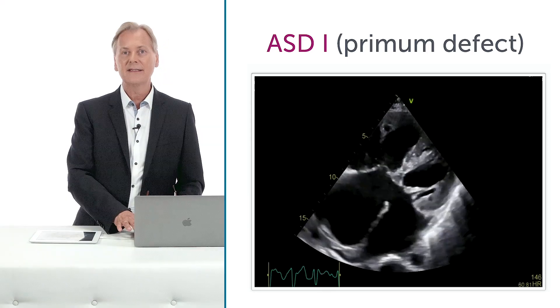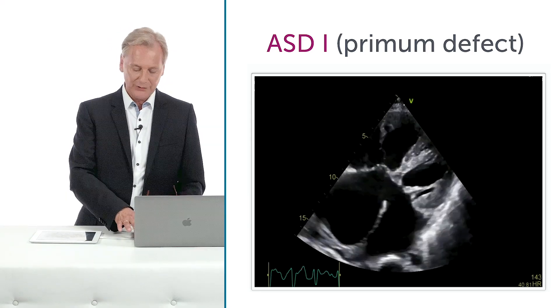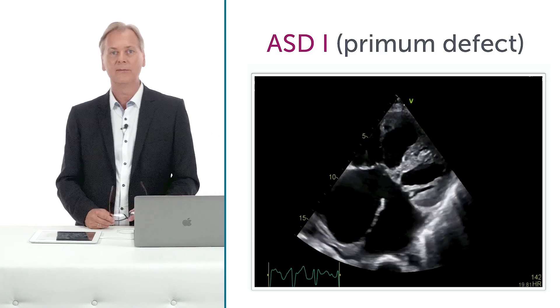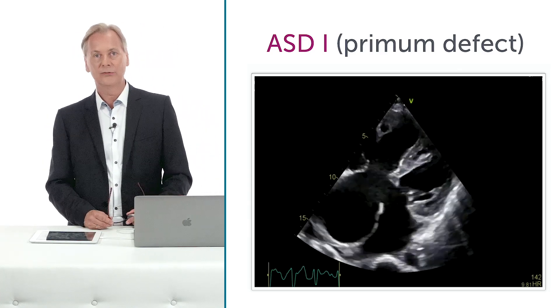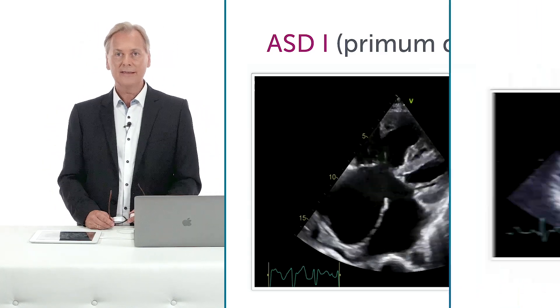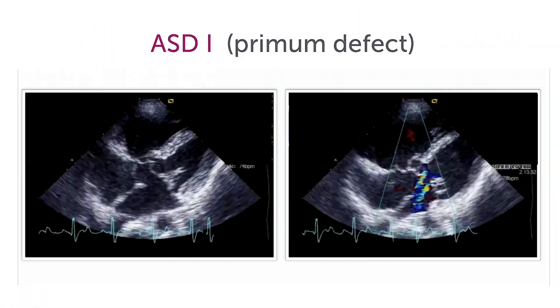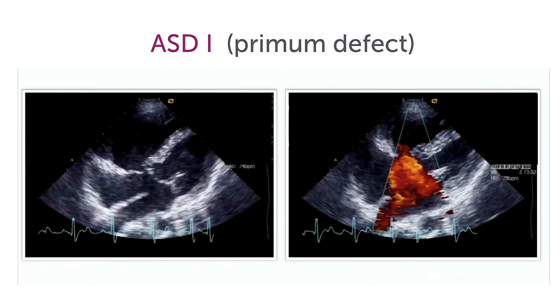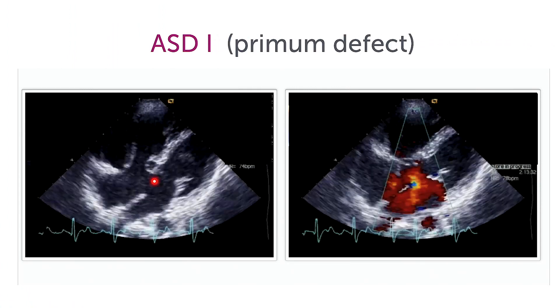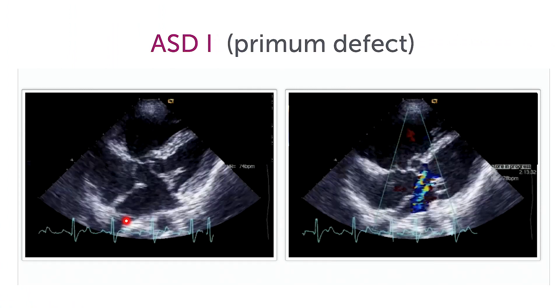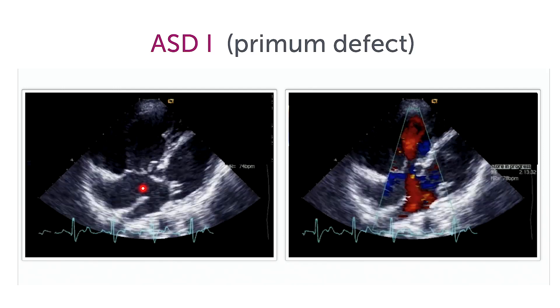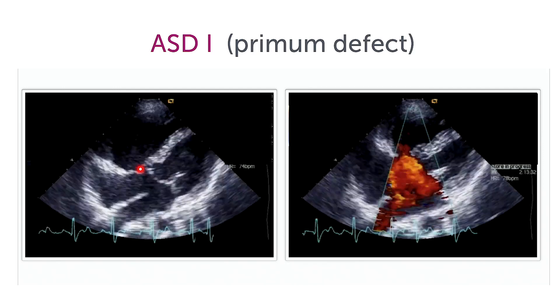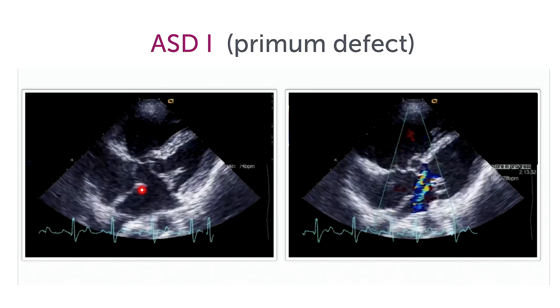This is the way an ASD1 looks, and it's usually very easy to differentiate it from an ASD2. Let's take a look at this patient here. You see again a large defect in the interatrial septum right close to the AV valves — again, a primum defect.